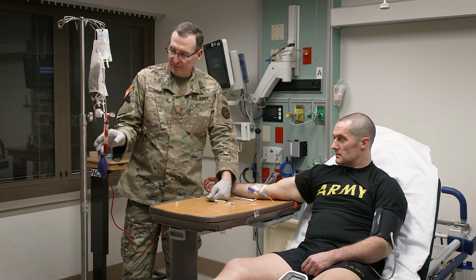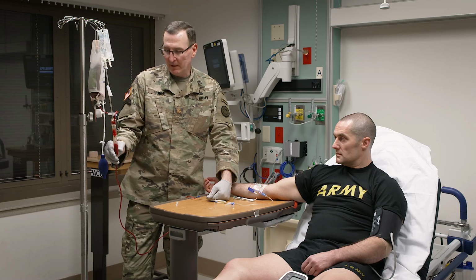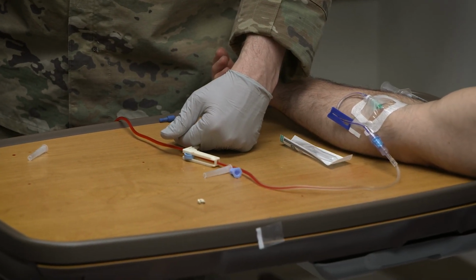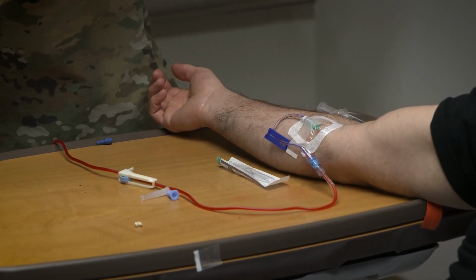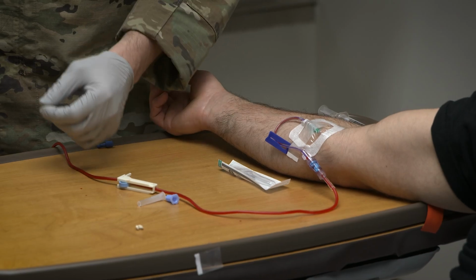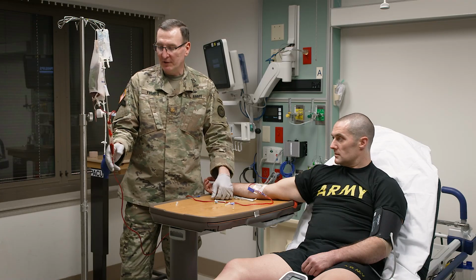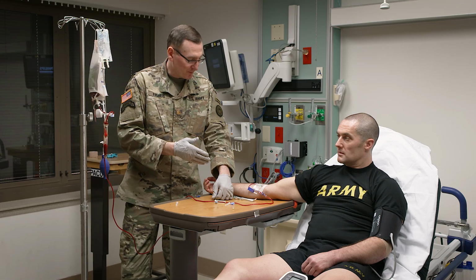The thing about this tubing specifically is that it has a filter in it. And that's important, that you cannot use just regular IV line with this. You have to use specific blood transfusion tubing because of this filter in here that can catch any sort of small clots, very, very tiny clots that you won't even be able to see. And so we want to make sure that that's safely done and we can administer this blood to our patient.